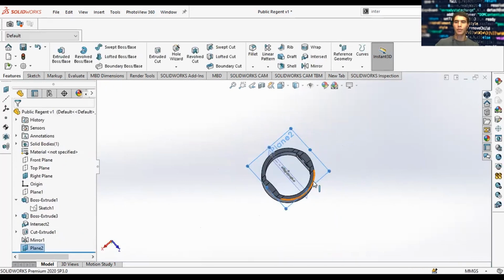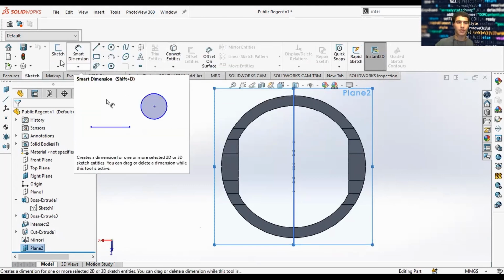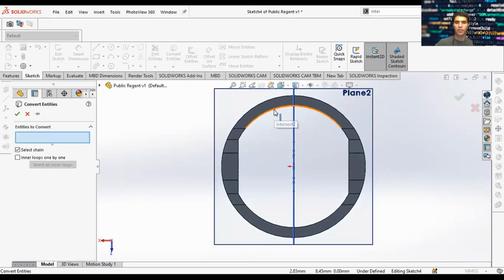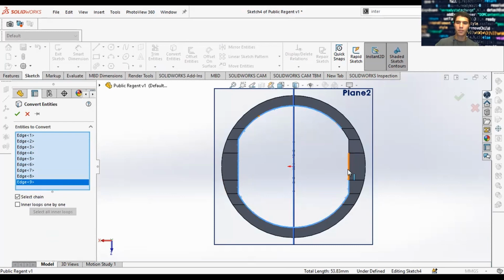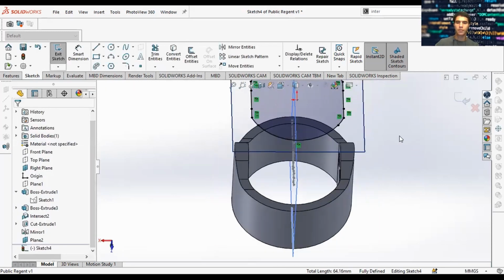And for this top plane, let me introduce you to a feature called convert entities. We're going to sketch on this top plane. We're going to convert the shape of this body that we have here. Selecting this chain of lines. And we're going to project it onto our plane. You see it?